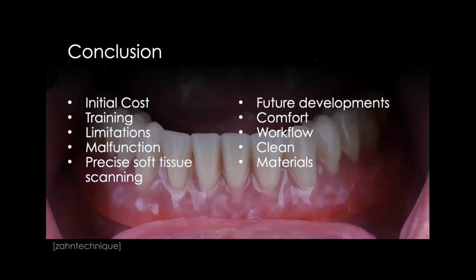I don't care where you are. You don't care where I am. I can be in Miami, you can be in San Francisco. We can work together like this in digital dentistry because you send me a scan, I can look at the scan immediately, evaluate, and give you feedback. We can FaceTime, we can do a Zoom meeting about that scan, and you can treat your patient on the spot with your technician literally at your side. I think that's amazing. Whether it's digital dentures, a crown, or whatever it is, moving digital makes life so much easier, right? It's clean.